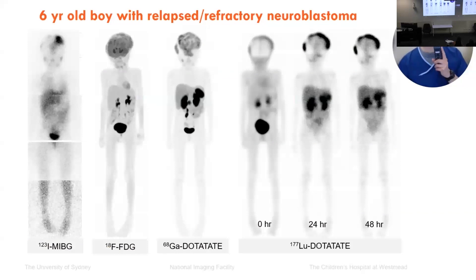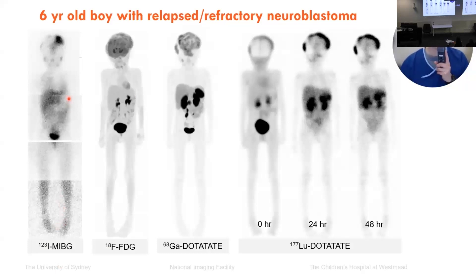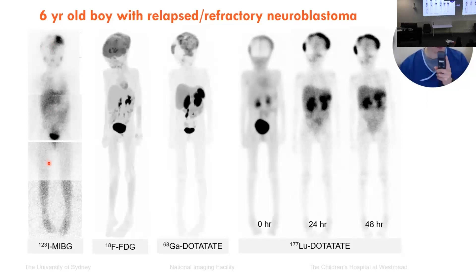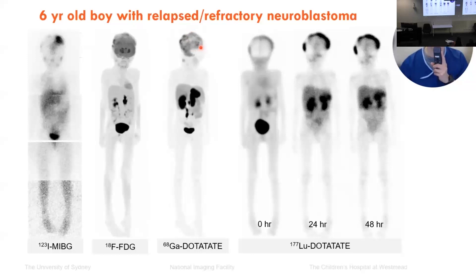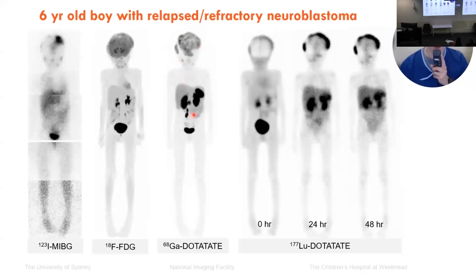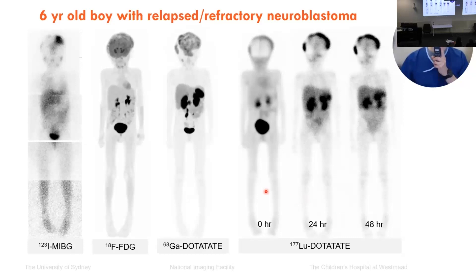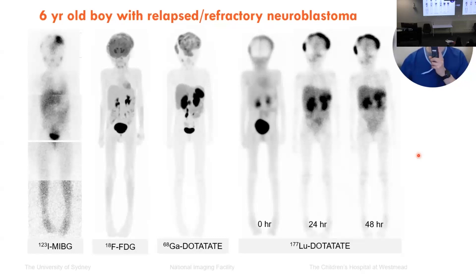This is the type of patient that will be enrolled on the study — images of a six-year-old boy with relapsed or refractory neuroblastoma. On the left-hand side is the MIBG scan showing metastatic disease within the skull. The subsequent FDG and Dotatate scans show how extensive the calvarial metastases are. The patient also has a nodal metastasis in the neck and one within the abdomen. This patient went on to have lutetium therapy, and here I show dosimetry scans performed up to 48 hours after administration.